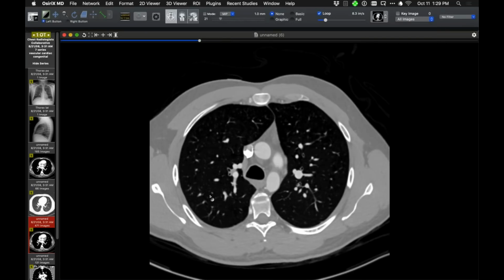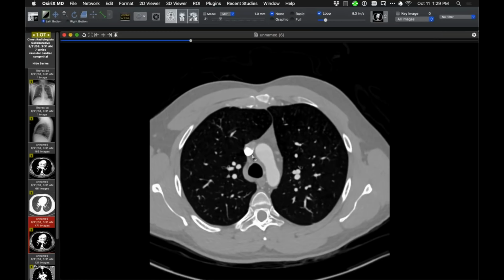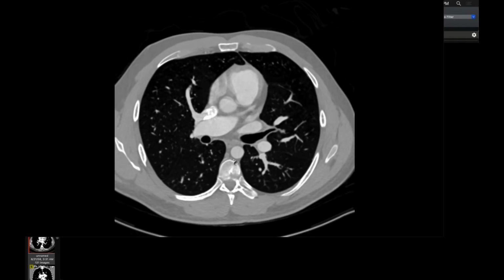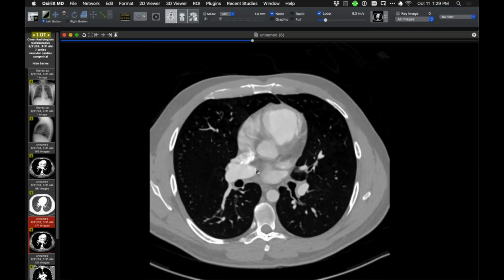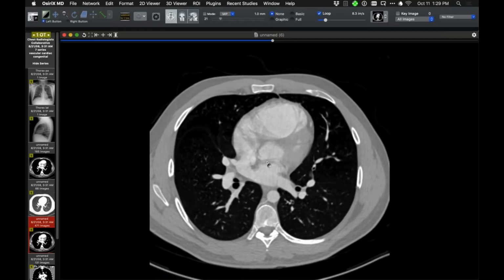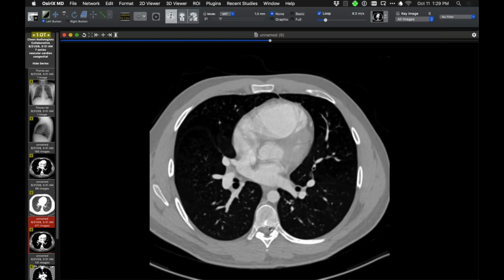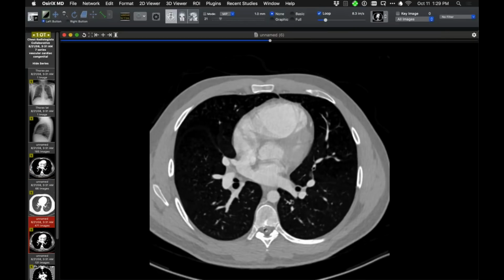So here are the findings. Keep an eye on the superior vena cava and see that there are pulmonary veins that will go into it there. And if you look here, we see PAPVR to the superior vena cava, and an association between that and sinus venosus ASD, superior sinus venosus ASD, down here is well appreciated. So that's what he has. He has a shunt and a combination of PAPVR and sinus venosus defect.